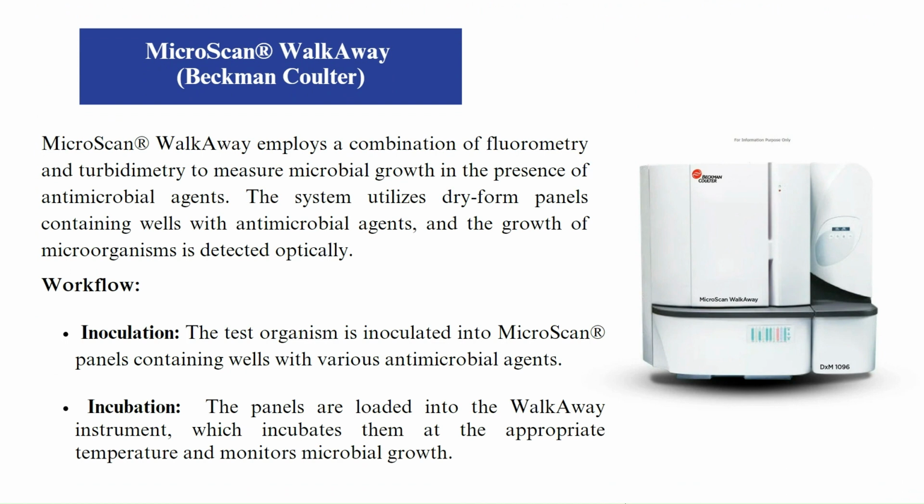MicroScan WalkAway employs a combination of fluorometry and turbidimetry to measure microbial growth in the presence of antimicrobial agents. The system utilizes dry-form panels containing wells with antimicrobial agents, and the growth of microorganisms is detected optically. In this system, the test organism is inoculated into MicroScan panels containing wells with various antimicrobial agents.